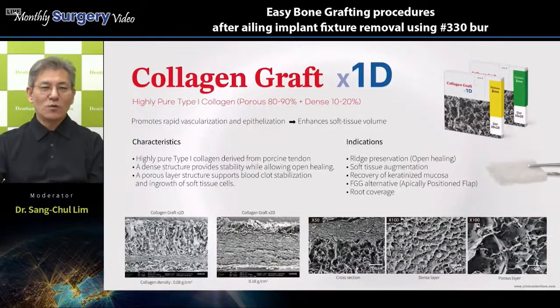Okay, another biomaterial will be introduced in this surgery: collagen graft. This one is the fastest growing in our market nowadays. Doctors, especially general dentists, want to use this collagen graft because it supports the open healing technique.